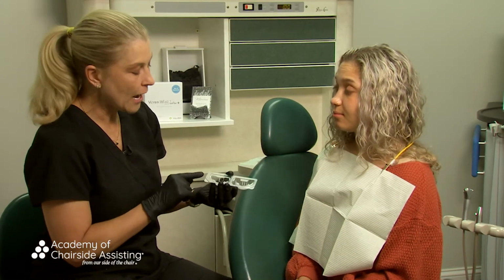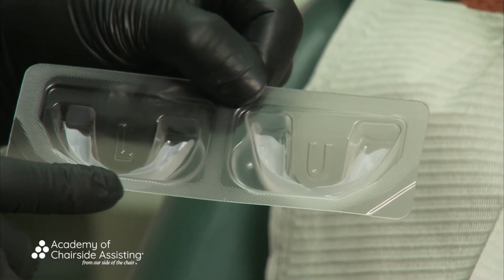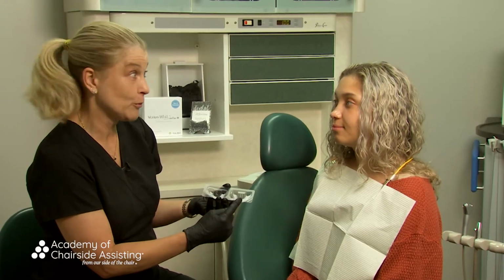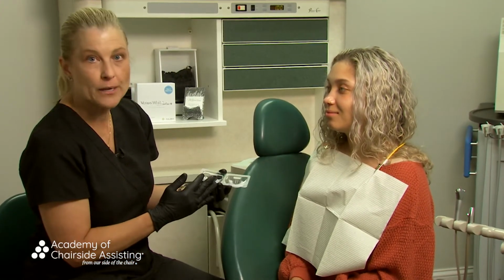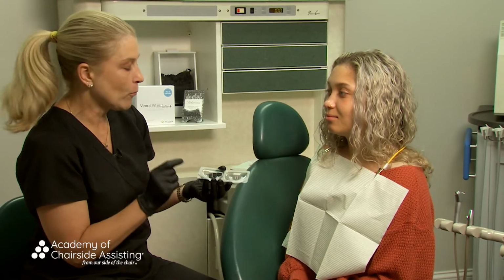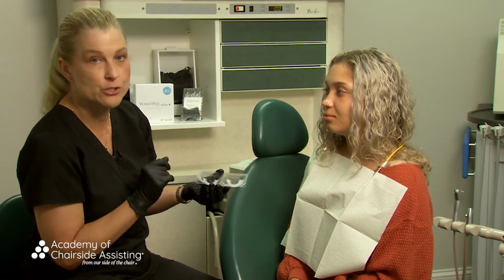And so what I want to just kind of feature first is exactly what the trays look like. There's a lower and there's also an upper, and making sure that you show this to patients. Believe it or not, people don't read. And I've had patients put the wrong tray on the wrong arch. I actually have one of these that I'll open up and use as a demo, just like I'm doing today to show patients. But what I want you to understand is there's a lot of bleach in here. So we really need to go through good, thorough home care instructions.